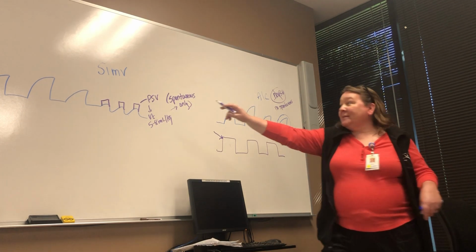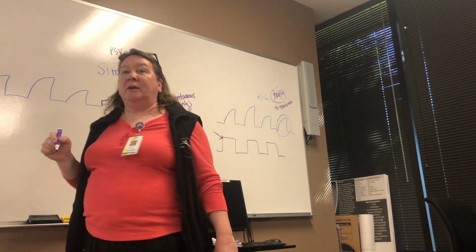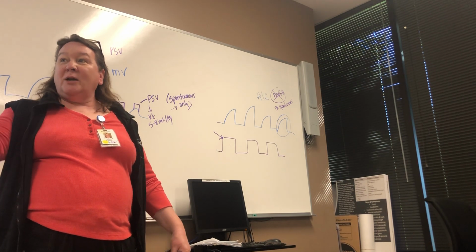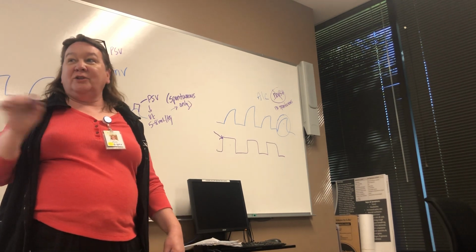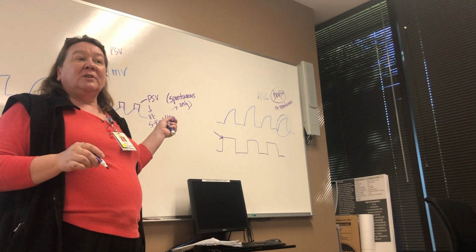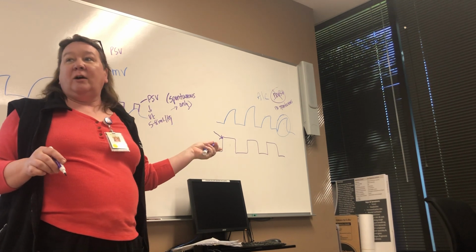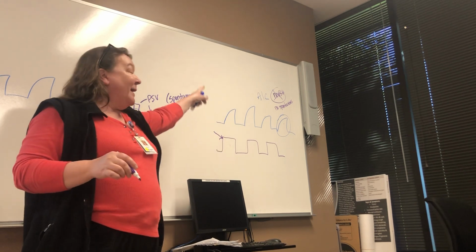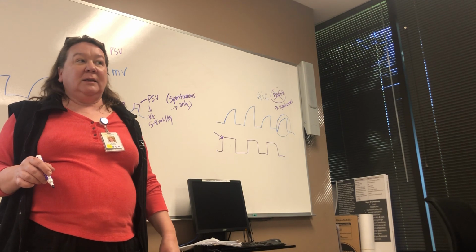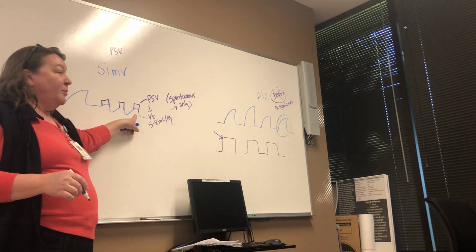Right. So remember, SIMV, pressure support. AC, no pressure support. So if you see an order for AC VC and it has pressure support in there, that's a no go because you can't do it. Because you have no spontaneous breaths. Don't confuse it with, some people say, I can't do pressure support because I'm not in pressure control. That has no bearing on it. You can't do pressure support in any AC mode because you don't have any spontaneous breathing. They're just patient triggered. These are actual spontaneous breaths that the pressure support can go on.